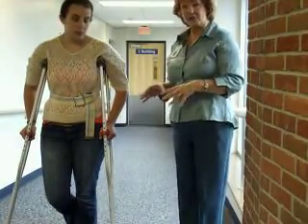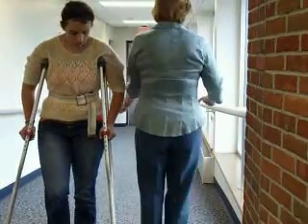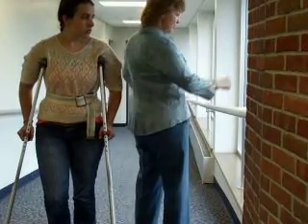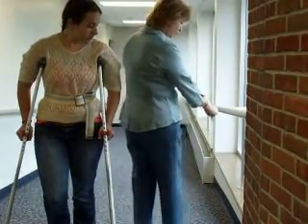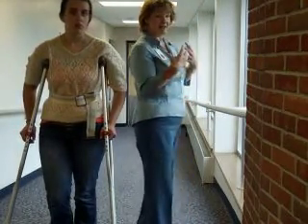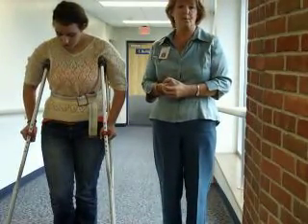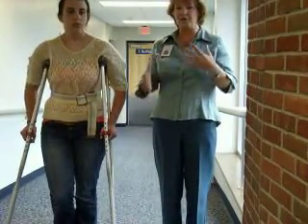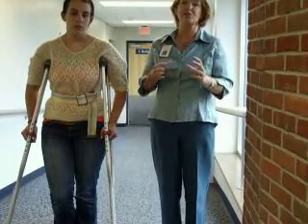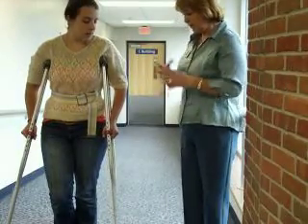If it's any other patient — for instance a partial weight-bearing patient — then you want the strong side down. That patient would be angled in that direction as they're going down, including their crutches. So the crutches, then the involved foot, then the strong foot — that puts their strong foot lower to catch them in case they start to lose their balance or have some momentum, to stop that momentum. If there's a patient who is equal on either side, they still need to turn at an angle; it just doesn't matter which side is lower.